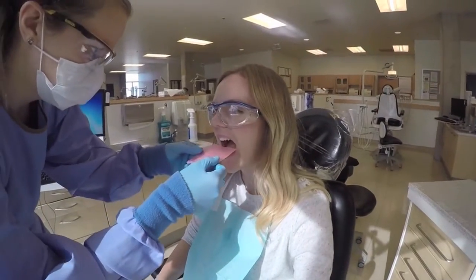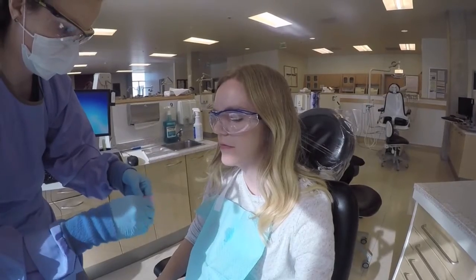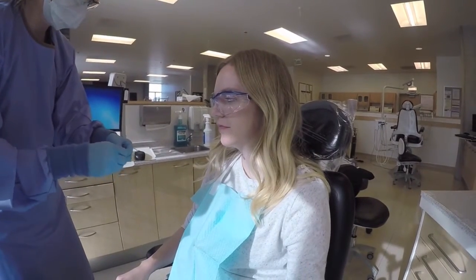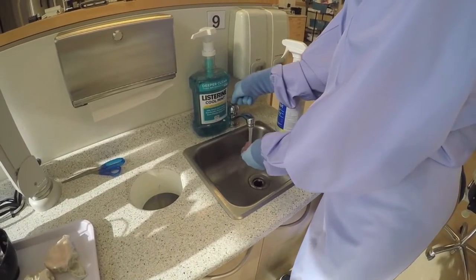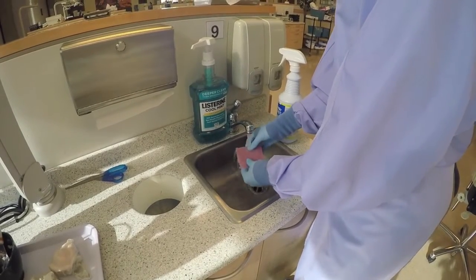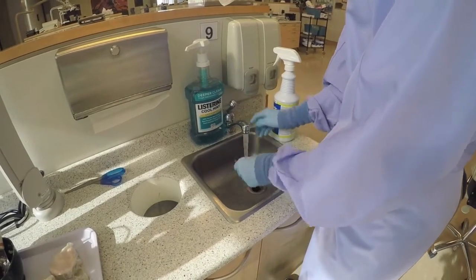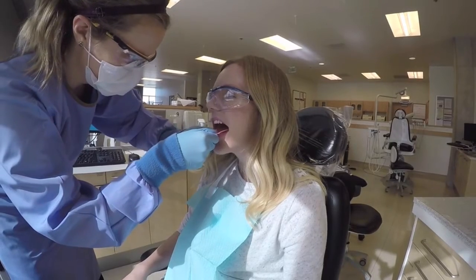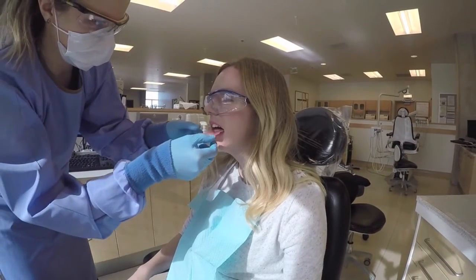The last step is to get an impression of the patient's bite using the wax square. Hold the square to the patient's mouth to check for size. Remove any excess wax. You will then run the wax under warm water. You will then insert the wax square into the patient's mouth and have them bite normally into the wax for about 5 seconds. Remove the wax and keep with the impressions.